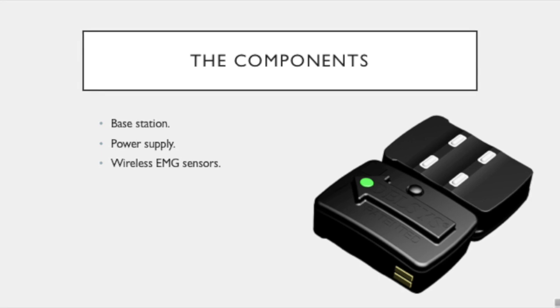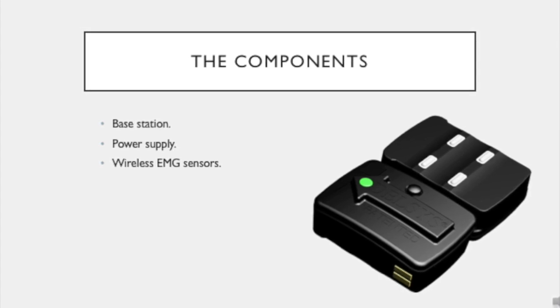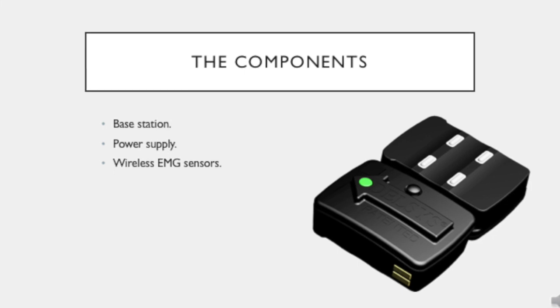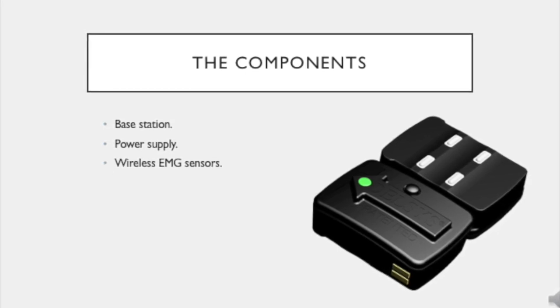If you look at the EMG sensor, you will see that there is an arrow as well as a button and a small LED. The button turns the sensor on and off. The LED indicates the status of the sensor.